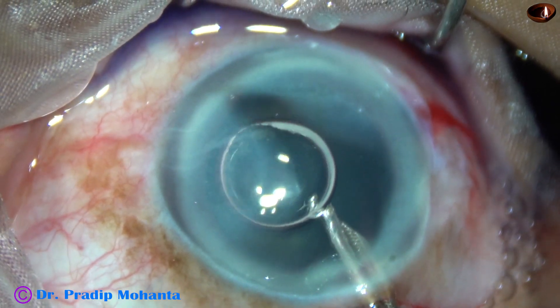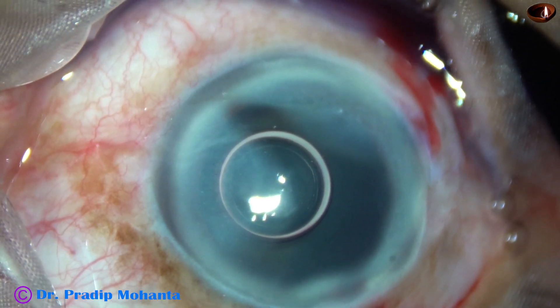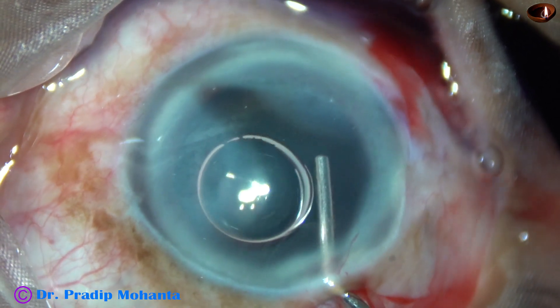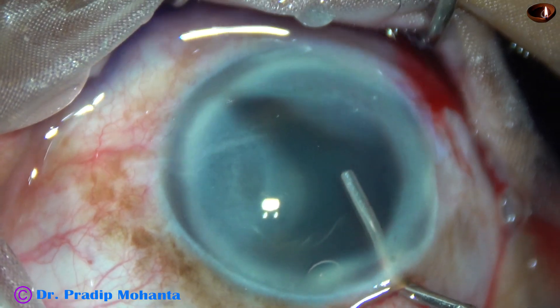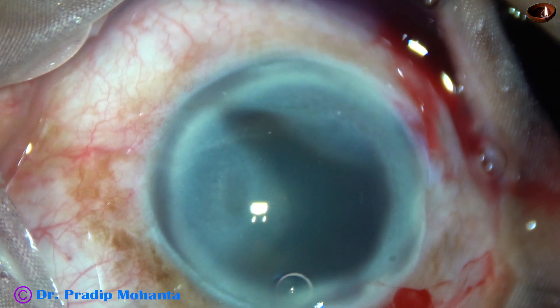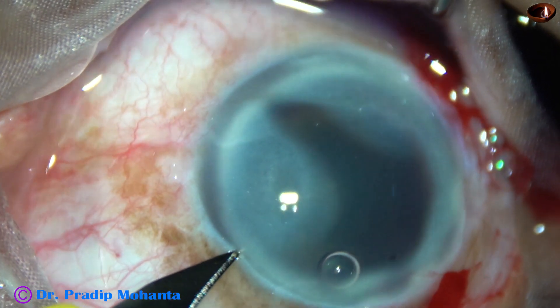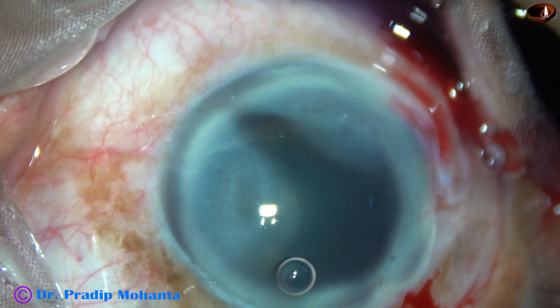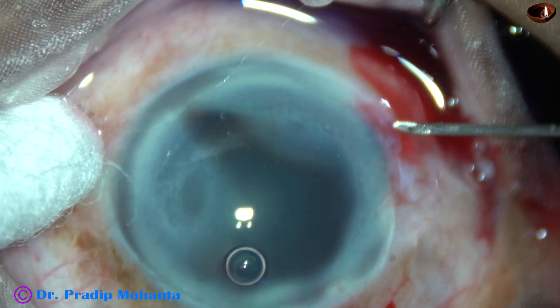And now the dye is washed out. And now visco — 2% hydroxypropyl methylcellulose — is injected into the anterior chamber. There is a small air bubble that may cause some disturbance. This is a side port just posterior to the limbus on the left side.